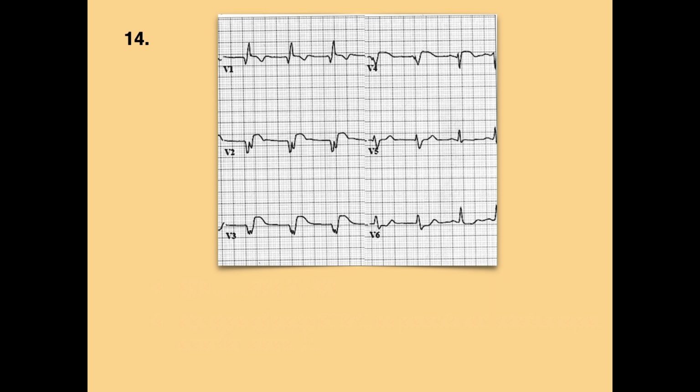Okay. So in lead 1, it looks like a little bit of elevation maybe. 2 is depression. 3 is depression. Let's look at V2. It's a very weird QRS, no question. But the J point is actually here. What we have is a Q, almost an R wave, because it should come up to the isoelectric, and then an S. It's very strange looking. So let's just call it a QS wave and leave it at that and not worry about exactly which one it is.